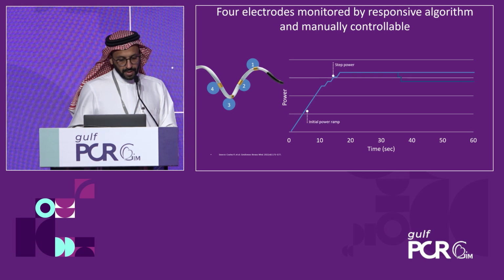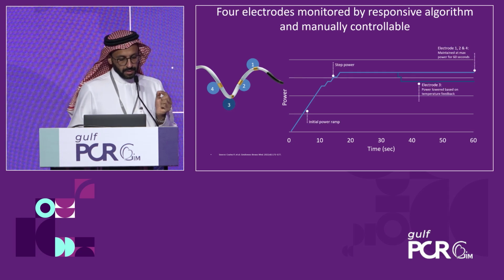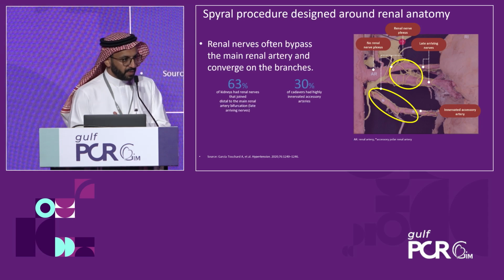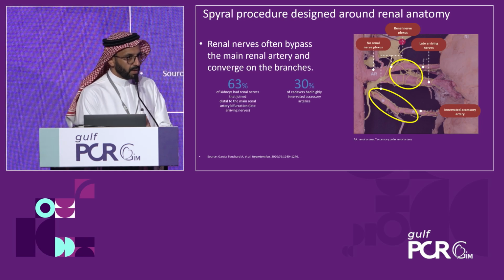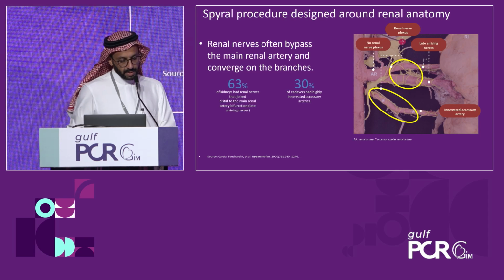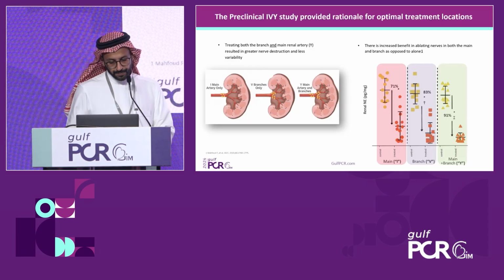This is a diagram showing the safety margin for the ablation spot, which turns off exactly when it reaches a certain level of heat that would cause damage. And contrary to the previous belief, where we usually ablated the main arteries, now they are advocating, based on evidence, to ablate as distally as possible, but not too deep into the parenchyma, with evidence supporting that when you do this procedure, specifically with this newly designed catheter, you achieve more ablation and more effective treatment.